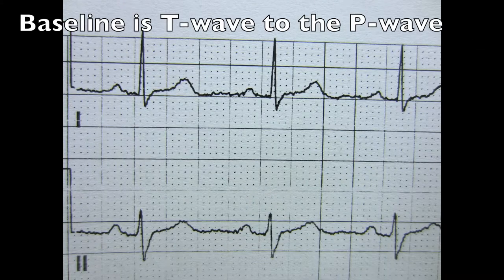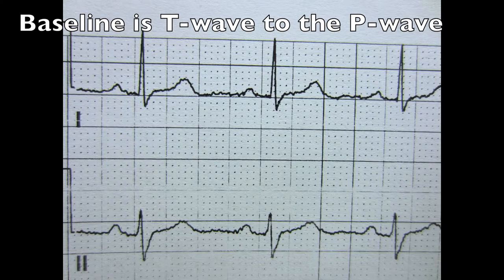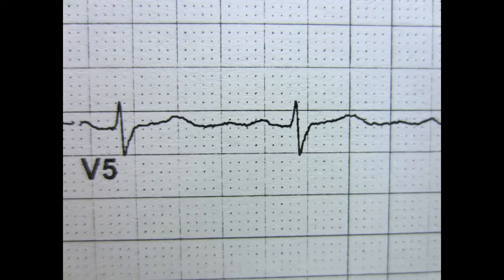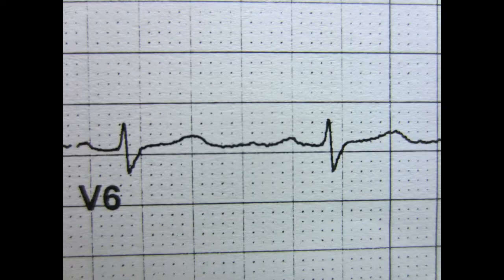The baseline is the TP segment. I don't see any peaked T waves, inverted T waves, or ST changes in lead 1 or AVL. No changes in V5, and no changes in V6.